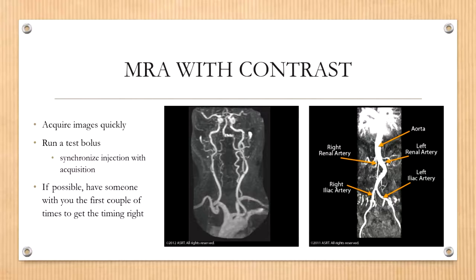I mean, in the grand scheme of things, it wasn't too bad because the patient just had to come back in a few days. But it's embarrassing, and you feel like you didn't do a good job, which you didn't, and you feel like you failed your patient. And then you also have to inject the patient with gadolinium a second time, which is not ideal. You don't ever want to give them gadolinium unless necessary.